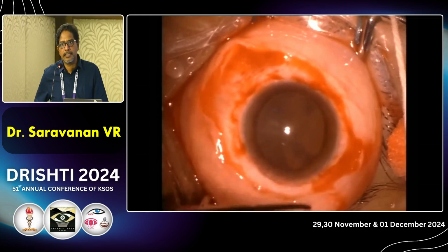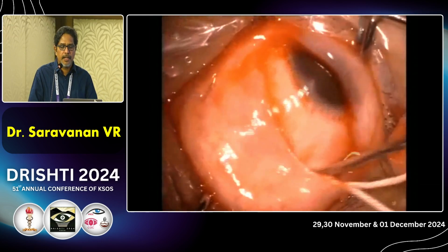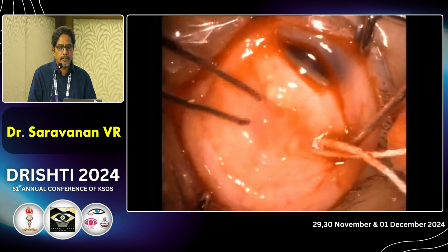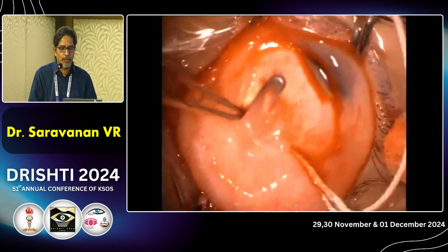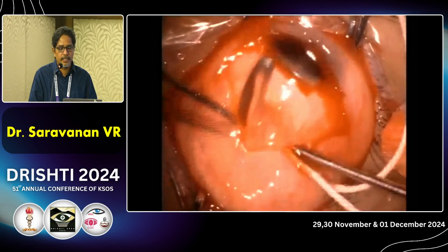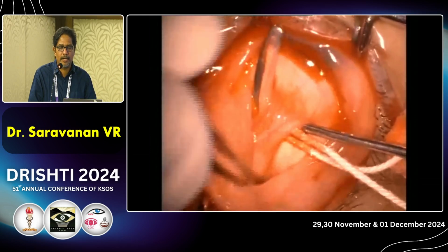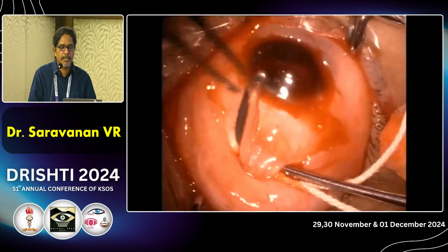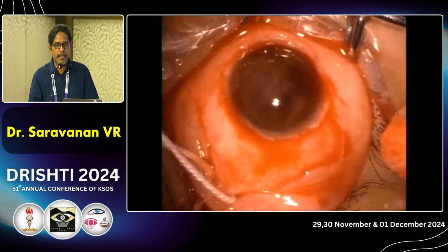Because in the olden days, probably we come from the old school, scleral buckling was the first choice for any rhegmatogenous retinal detachment. And at that time, when I was starting to do my surgery, there was no SICS or phaco, most of them were ECCE patients. When you do surgery, if you have an ECCE wound, it will definitely open up during the buckling surgery, and it makes a mess. Once the eye collapses, there is a lot of pigment dispersion, and it becomes doubly difficult to visualize the posterior segment, especially through an indirect ophthalmoscope, and it makes surgery very, very difficult.